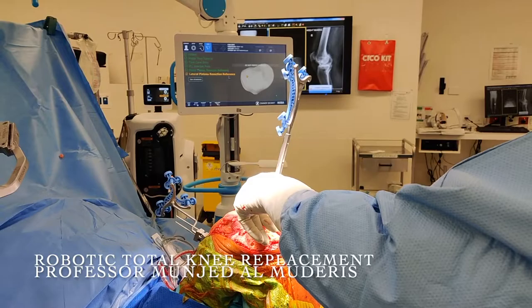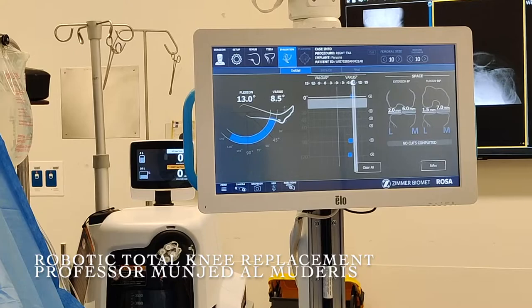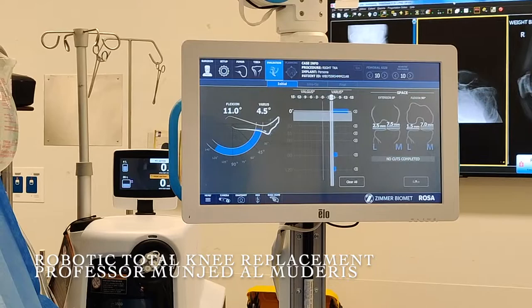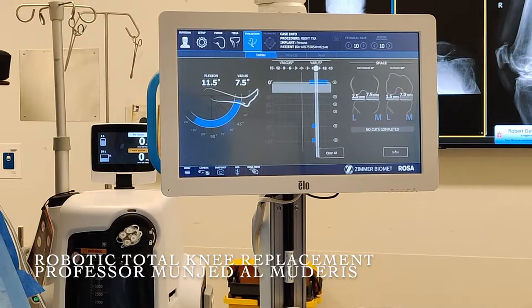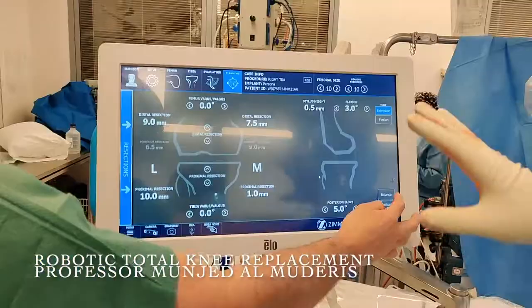After finishing the surface landmarks, we identify the position of the knee in space. This patient has a varus medial alignment of 8.5 degrees after the release, with a fixed flexion deformity of 13 degrees. The deformity can be exaggerated to 13 degrees of varus and minimized to 4 to 4.5 degrees of valgus. At 90 degrees of flexion, there is 10 degrees of varus reducible to 1.5 degrees of valgus, with significant opening in flexion. In extension, there is less give.